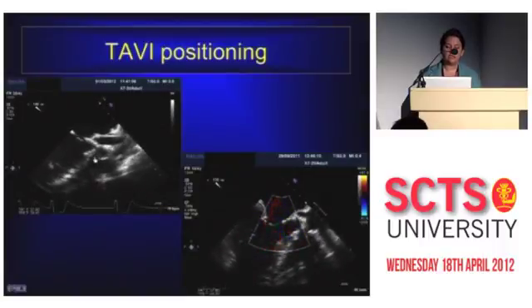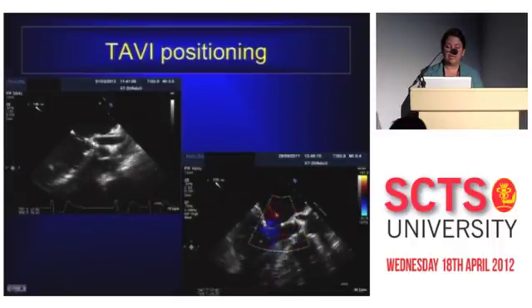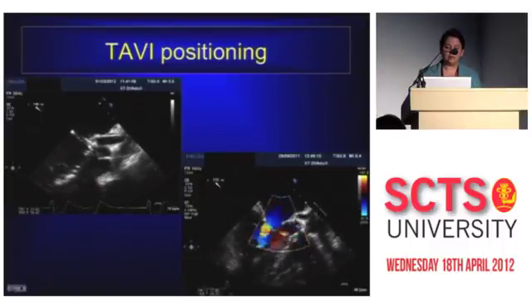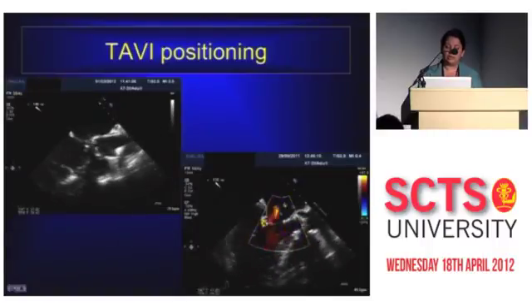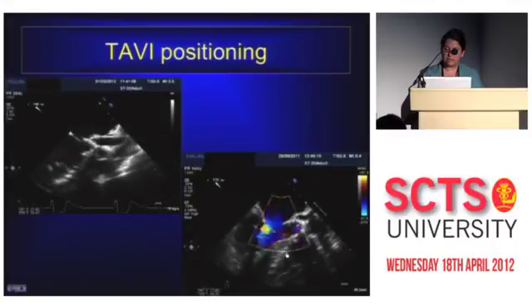And at this third, it's vital to see that it's not impinging the mitral apparatus, and that it is covering the area that you need to cover, which is the aortic valve hinge points. So it needs to be underneath the annulus but cover the calcium that you're likely to encounter there. Now, that positioning is important with colour as well, so you see whether you are going to leave the valve exposed to a lot of paravalvular AR, and indeed whether you're going to cause problems with mitral regurgitation.